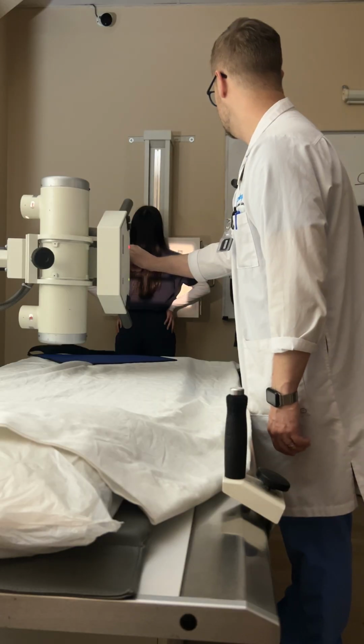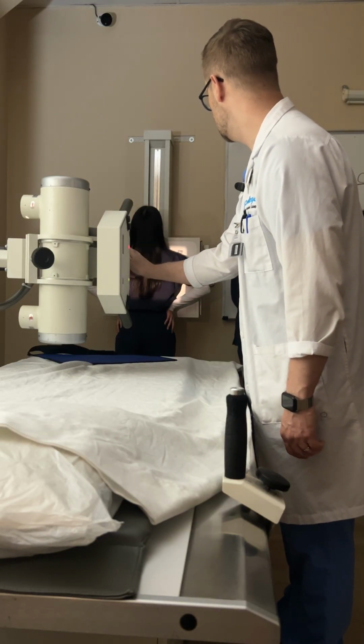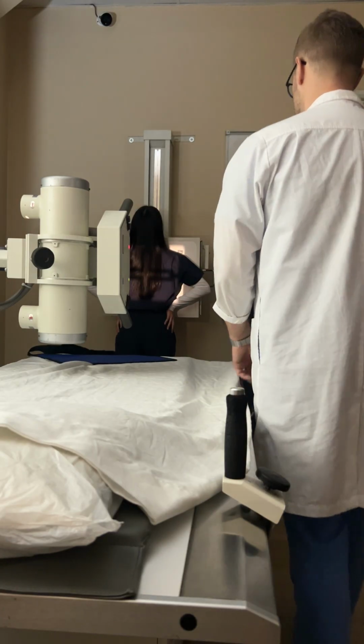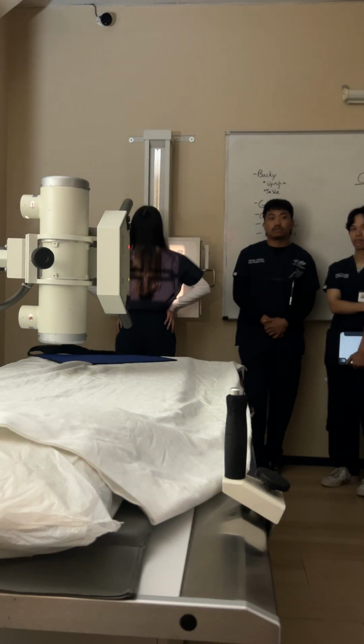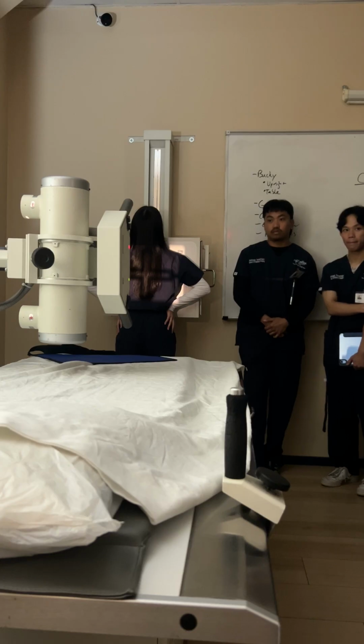We're going to refine it because we've got a cassette in portrait, and she's not a large lady. So we're going to bring that collimation in. She has a shield on. I am making that distinction very clear that I did not forget. Okay. Everything look good to you guys?